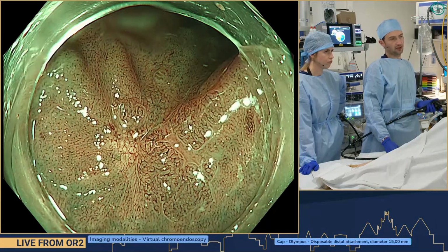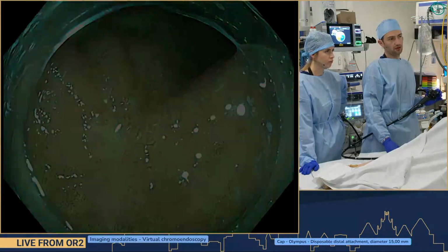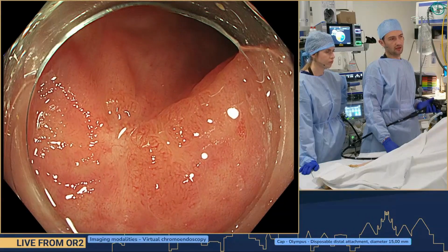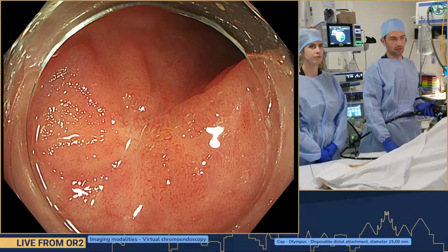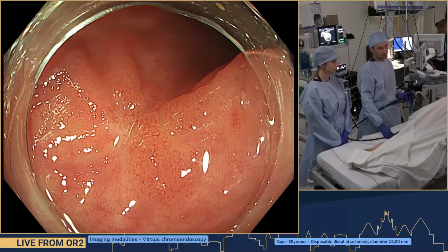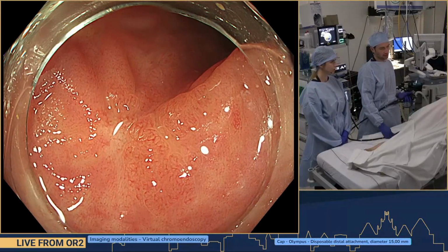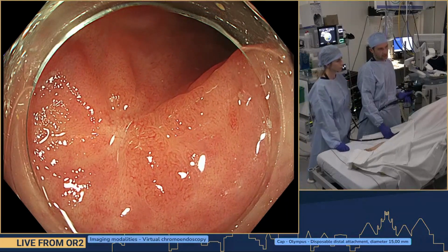And that really goes to show what I was saying before, right? So I just presented you a study where we found that the majority of recurrence is, and we're talking about that study, by the way, I maybe didn't say it, was in over 20 millimeter lesions, right? This lesion was definitely not 20 millimeters in size, ever, even before it was resected. So that study was in an expert center.